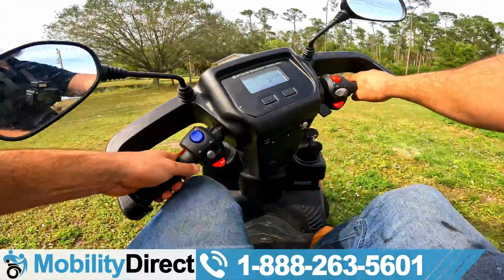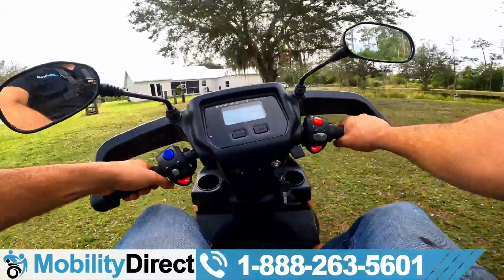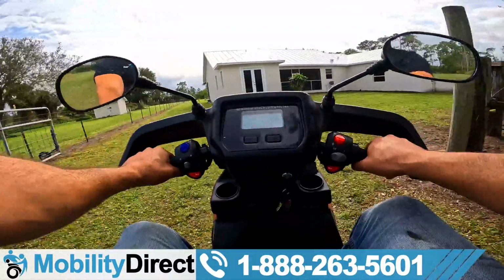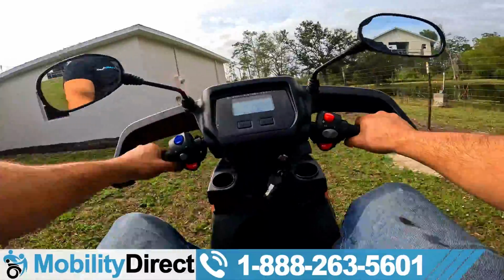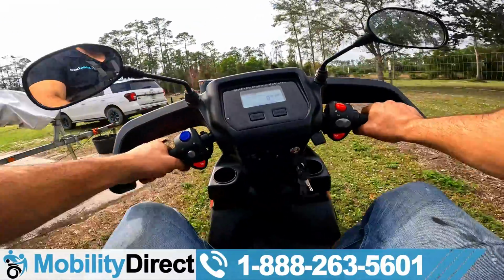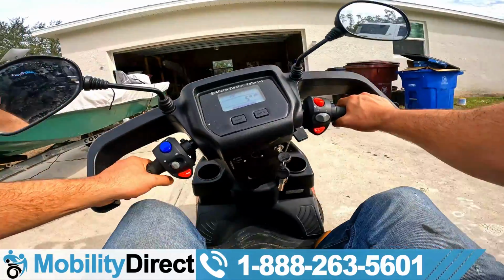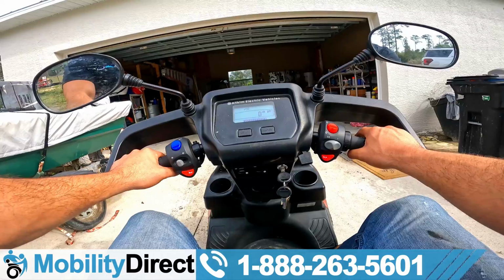If you have a loose wire somewhere or a loose connection to a wire somewhere, and you're going around on rough terrain and it's shutting off randomly, it's just one of 2 things. Either your batteries are old and they're not able to hold a minimum voltage of 24 volts when under load, aka when moving, or the error code is exactly correct, meaning you have a loose connection somewhere, folks.